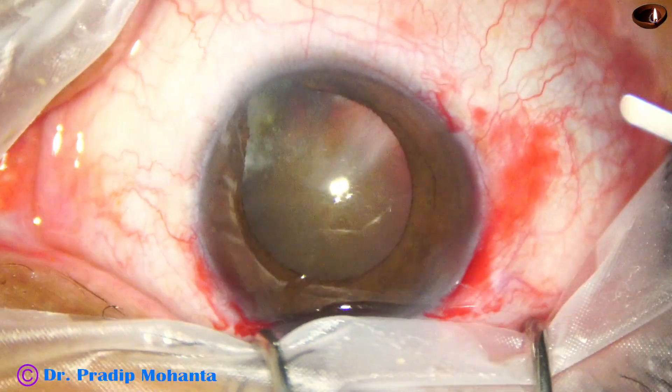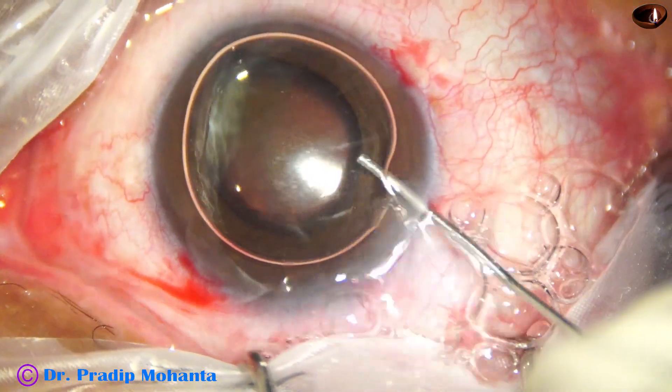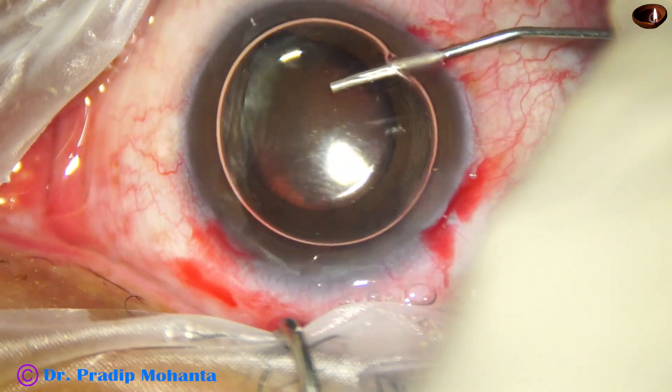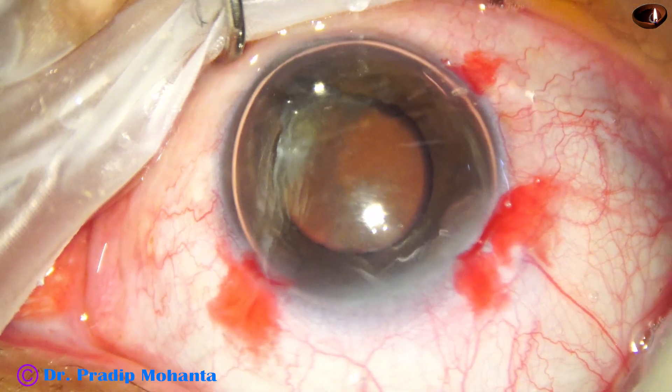See the oozing of blood from the incisions. When you do the incisions, you can include some capillaries in the wound, and healing is much better if you include some capillaries.